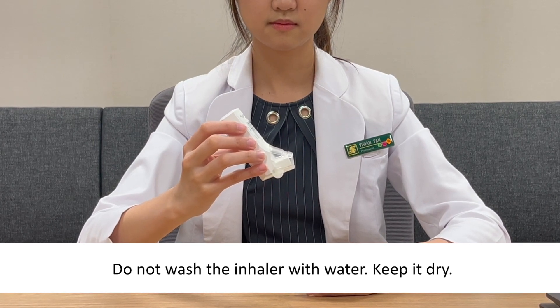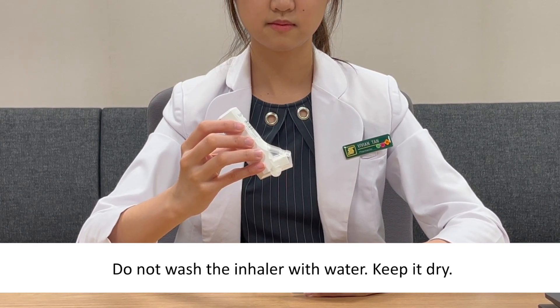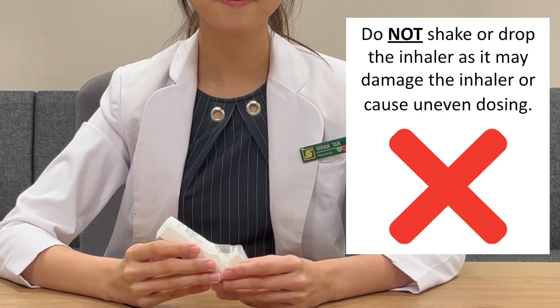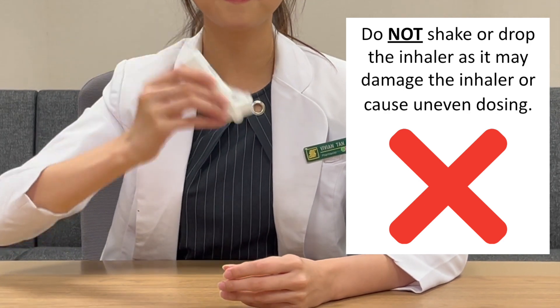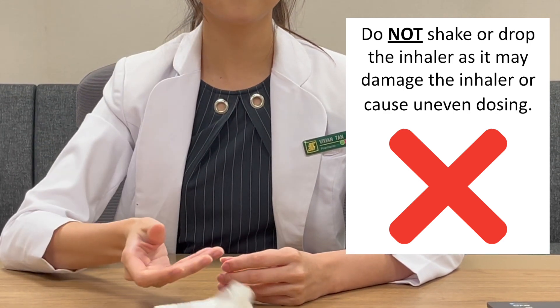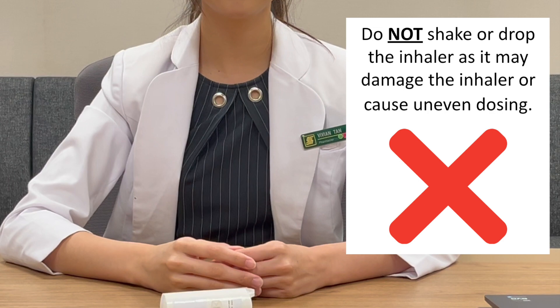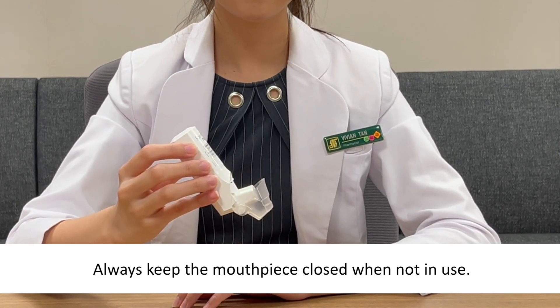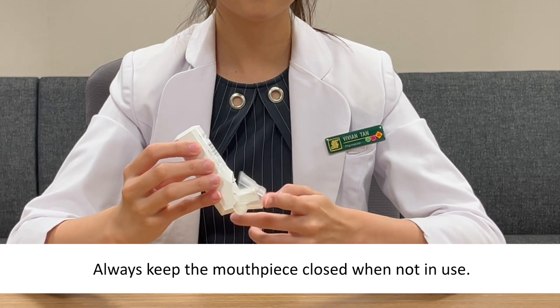Do not wash the inhaler with water. Keep it dry. Do not shake or drop the inhaler as it may cause damage to the inhaler or cause uneven dosing. Always keep the mouthpiece closed when not in use.